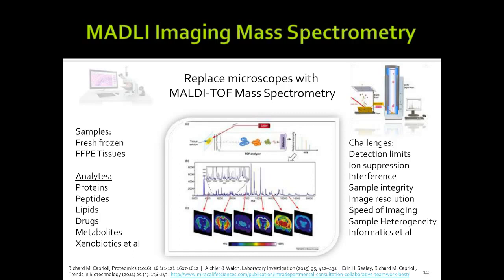How do we really have enough sample pool to develop the patterns for us to use to differentiate the different stages? So that's also a critical component. And by the end of the day, there's another area, which is informatics. How do we handle all this data? All of those are interesting, important questions to ask, and also related to image and mass spec.